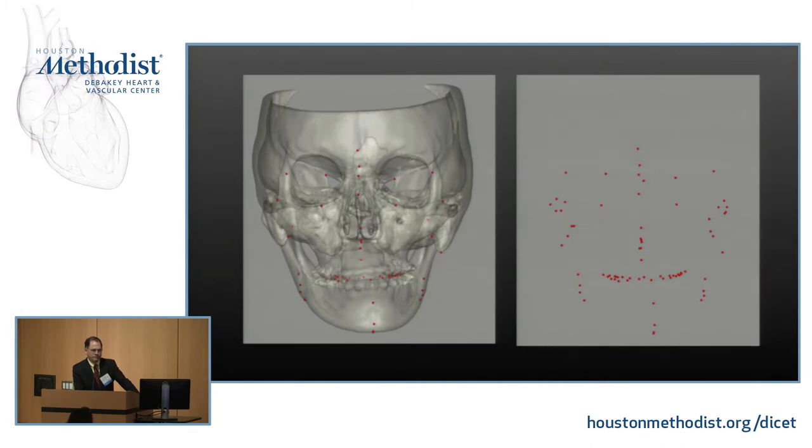In the past, we were very artistic about it. What we want to do now is to do this with mathematics. So you have a face that is asymmetric, and you need to construct it to symmetry and give it a normal shape. The most important thing is you have to create a frame of reference to the face. However, when you do a CAT scan, the position and orientation of a CAT scan as it comes out of the scanner is random. And we need to create the sagittal plane, the coronal plane, the axial plane. However, when a face is completely asymmetric, there are no frames of reference. So how do we go about building a frame of reference to the face when everything's asymmetric?